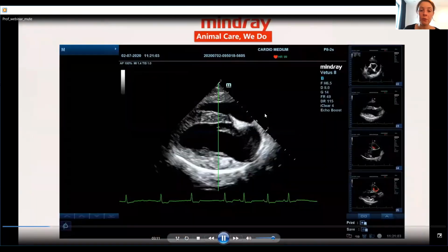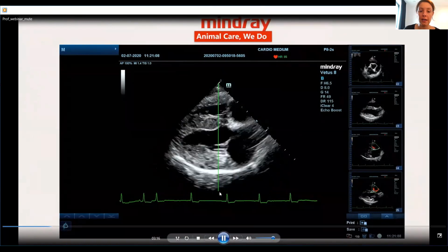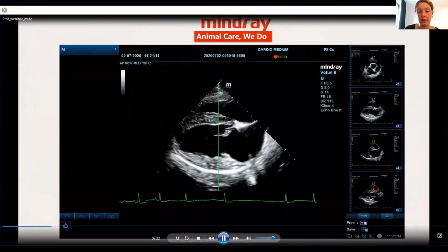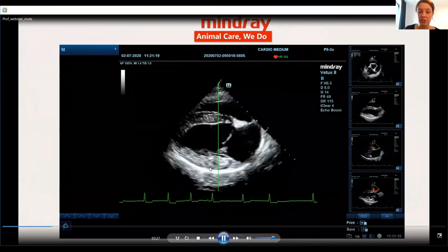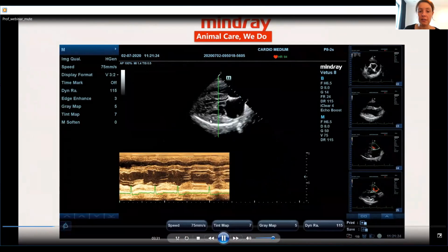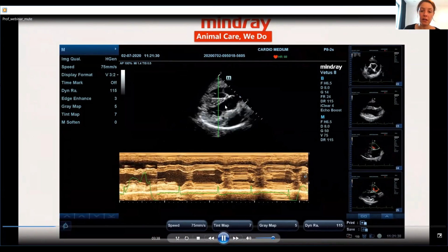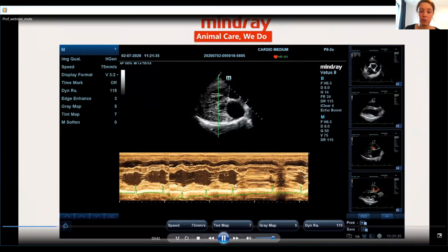What I'm doing now is putting an M-mode line through the long axis image. I'm trying to aim it so that it is between the mitral valve and the papillary muscle, but you can already see the challenge. Sometimes you see the papillary muscle coming into the image. You can also see sometimes the chordae coming into the image. That is what you see here. But if you have a couple of good cycles, then you can do a measurement.